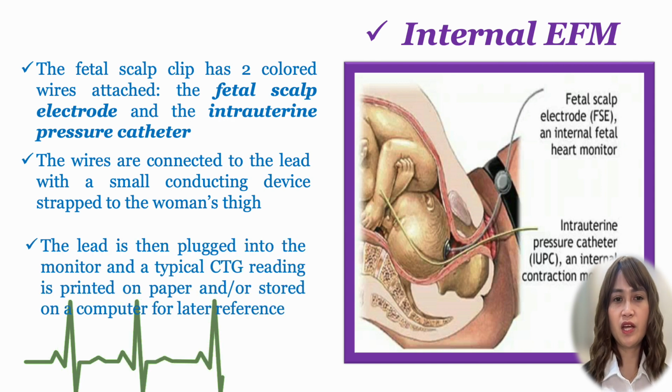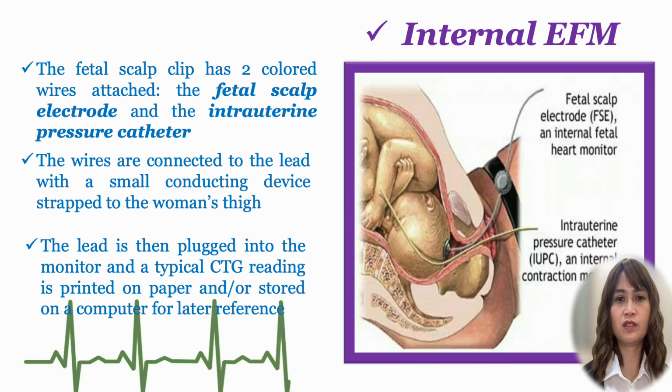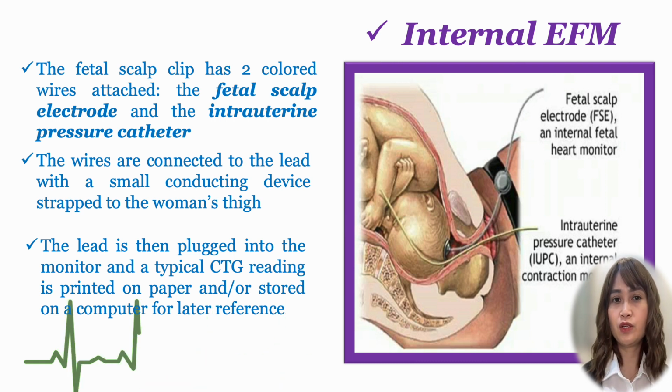The use of CTG and a computer network allows continual remote surveillance. A single nurse, midwife, or physician can watch the CTG traces of multiple patients simultaneously via a computer station. This procedure should not be any more uncomfortable than a normal vaginal examination. The internal electrode monitors the baby's heart rate more accurately than an external Doppler.